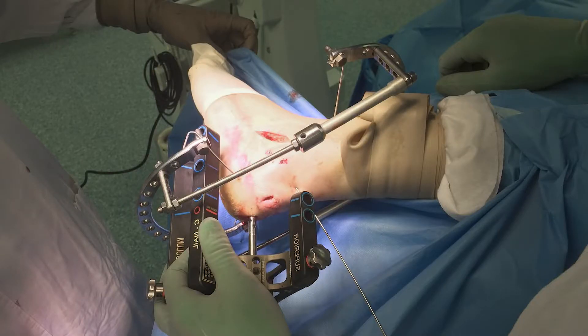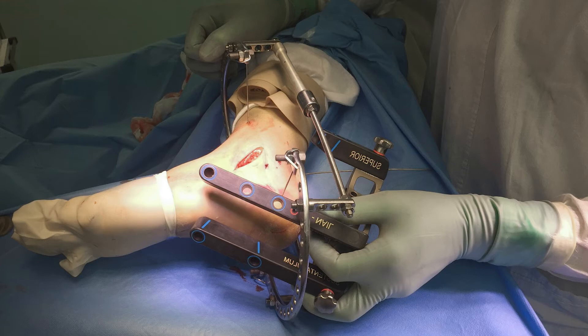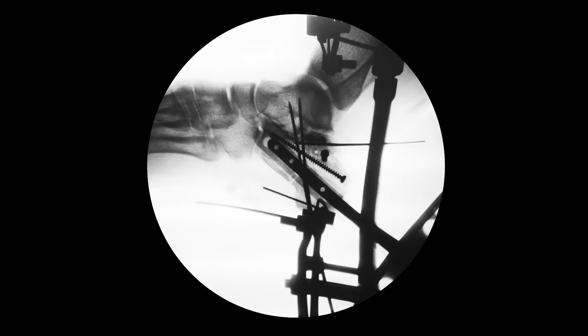Then the nail with the aiming device was installed into the canal. Please note that there is no need to remove the distraction device to insert the nail. Thanks to Dr. Gluchov from Yekaterinburg for developing the design of the distraction device and the possibility of using it together with the nail and its aiming device.